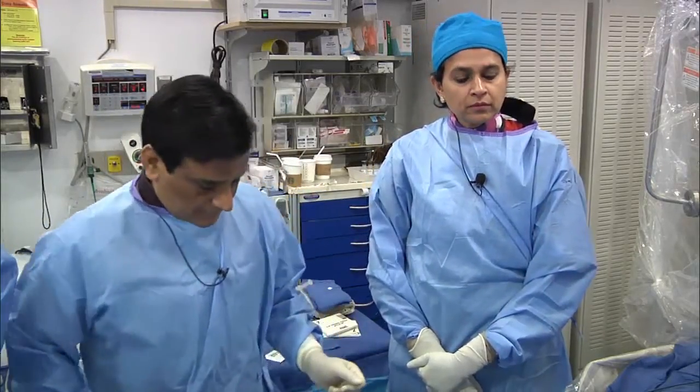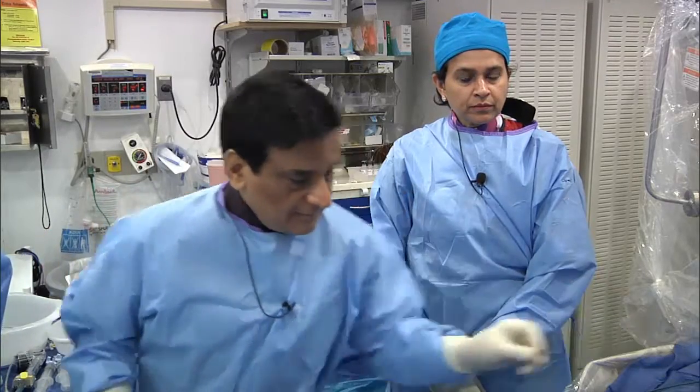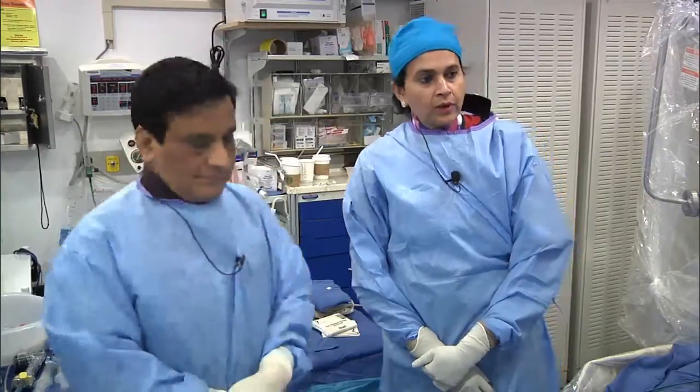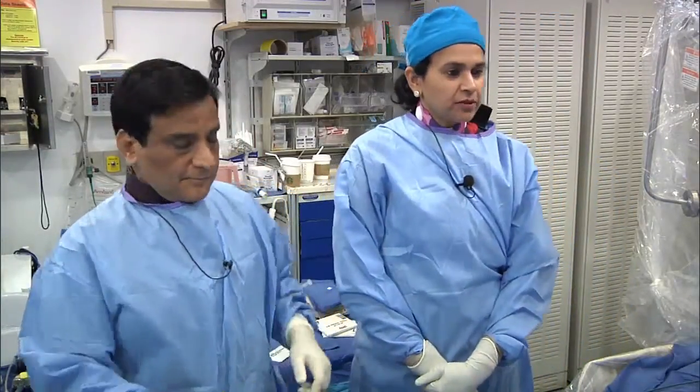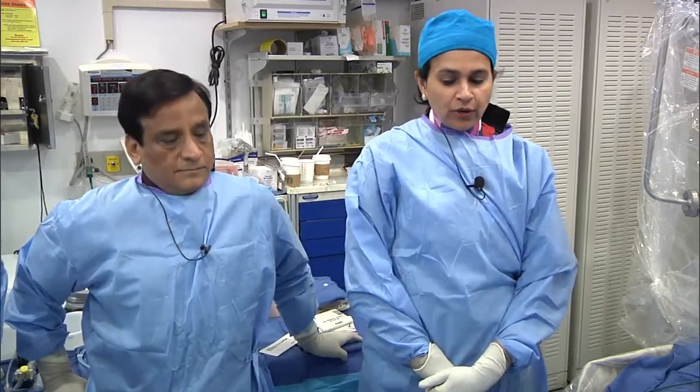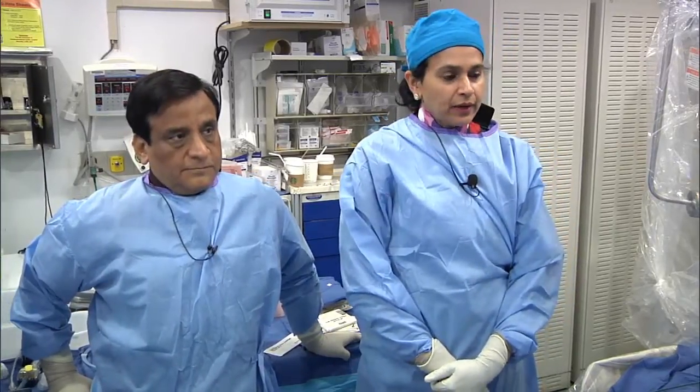Anu, a little discussion with you. Would you have done anything different? Would you have a different strategy? Here at this time, if we have to continue maybe another 5-10 minutes, try to recross right from the beginning again, the question is, what is the wire? One thing that we could have done is just leave the wire there and go with the Fielder.